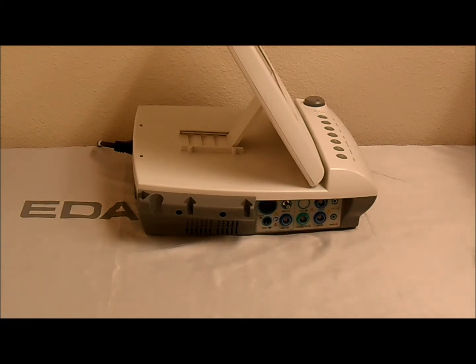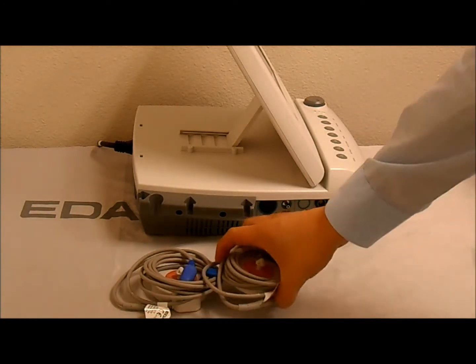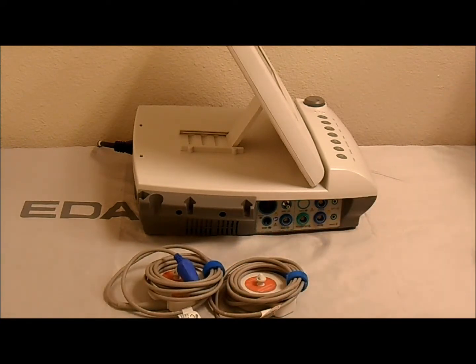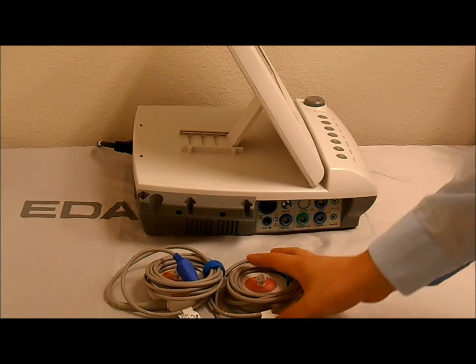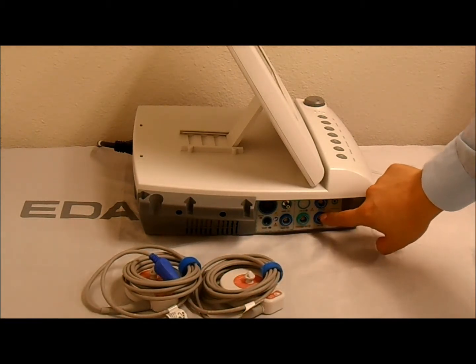First, we'll start with your fetal heart rate transducers. You should get 2 fetal heart rate transducers. This is how you can perform readings of the fetal heart rate of the fetus. So there's 2 of them, and they connect on the FHR1 and FHR2 ports of the monitor.